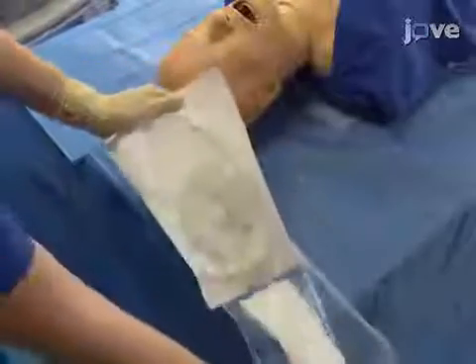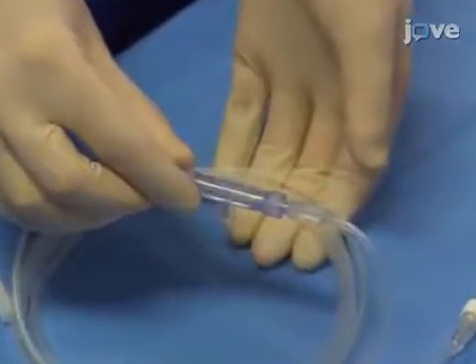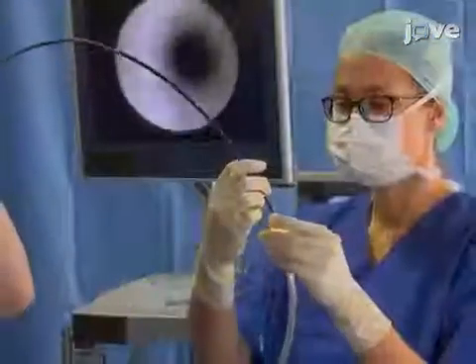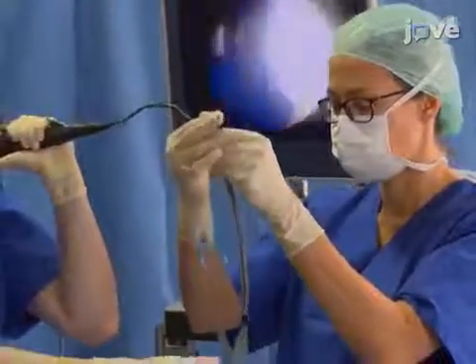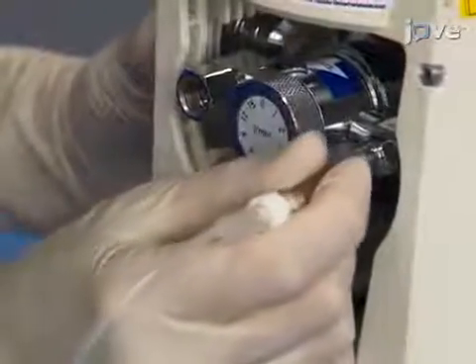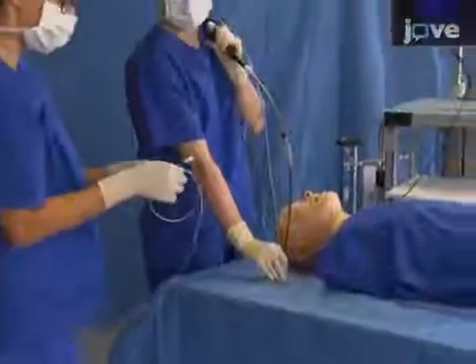In preparation, have ready an inspected, undamaged atomizer ready for its intended one-time use. Assemble and check a flexible intubation endoscope, and then railroad a suitably sized cuffed and lubricated flexible endotracheal tube over the endoscope. Then connect the oxygen tube of the atomizer directly to the oxygen flow meter, without a humidifier bottle, as they are incompatible with the atomizer.